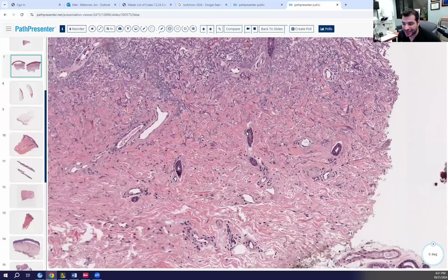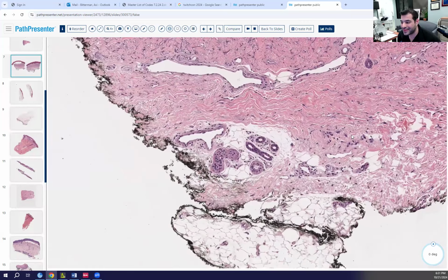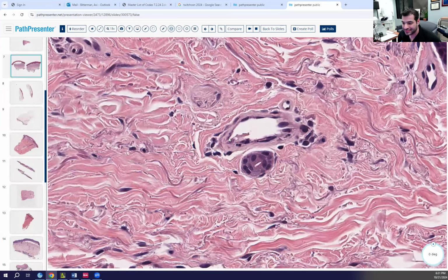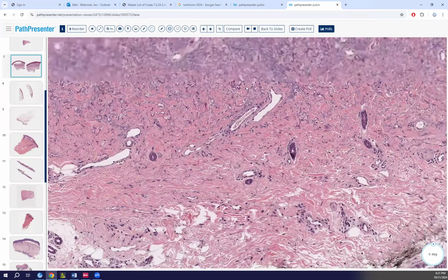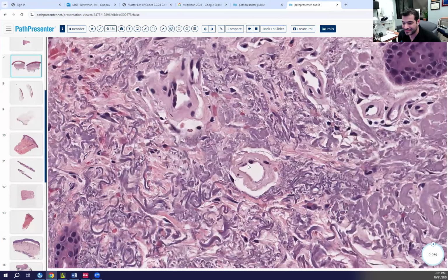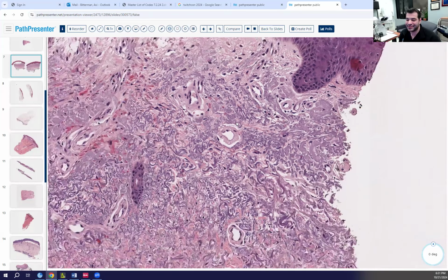You can differentiate that from EPP, and we'll go into that. But look at this vessel. Does that have this hyaline material deposited around it? No. Okay, it's really deep, where the sun doesn't shine. What about these ones? Yes. So that's another feature.